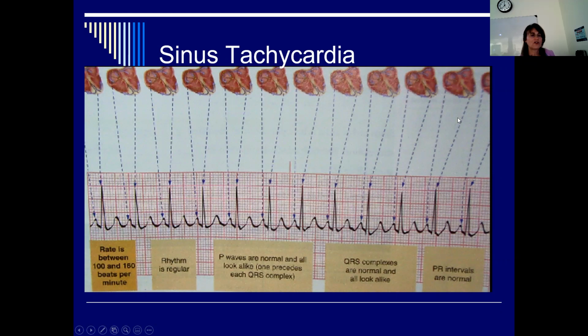Very good. Is the QRS normal? It's like 2 little boxes. If you look at where it begins to leave baseline to where it returns to baseline, it looks like 2 boxes.